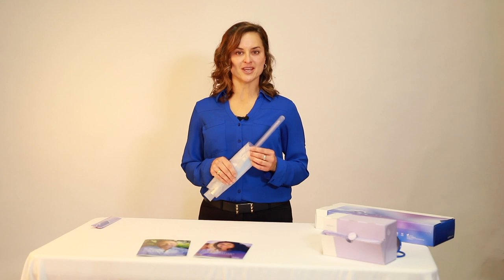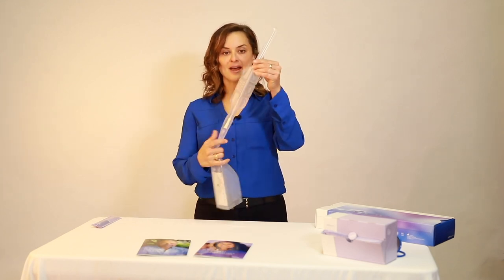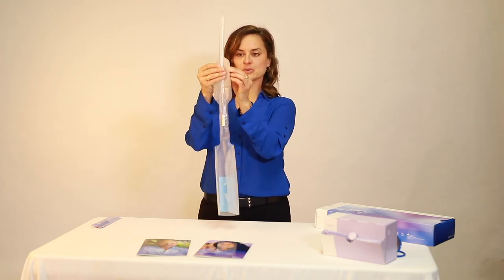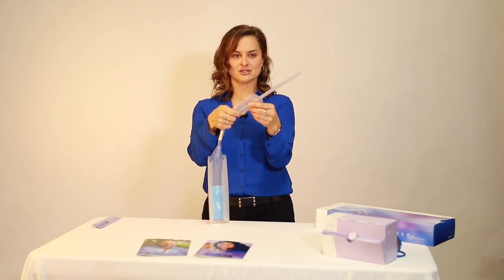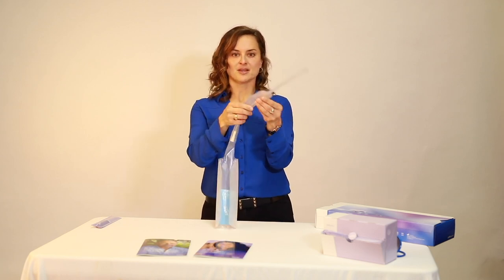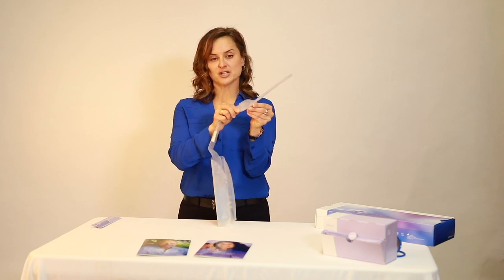Lofric HydroKit is our ready-to-use all-in-one Lofric catheter system with an attached collection bag. It features finger loops to assist those with reduced hand function and has a built-in insertion grip into the packaging — the centerpiece here — to allow for a firm grip and a no-touch insertion.